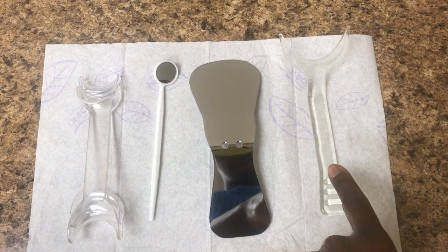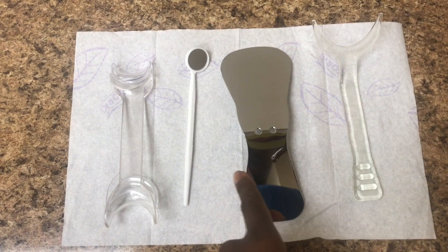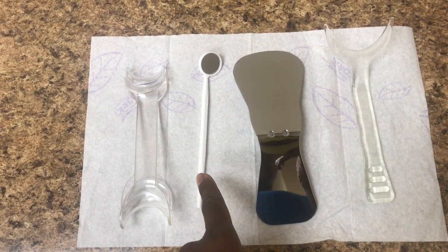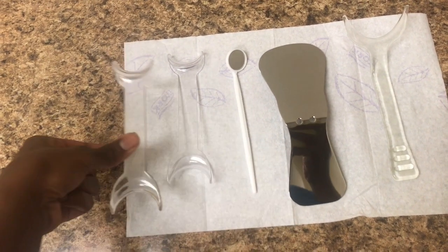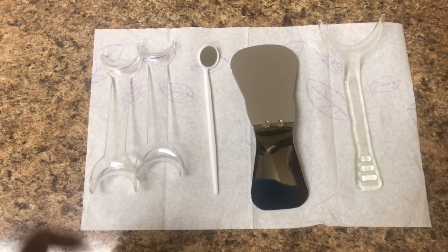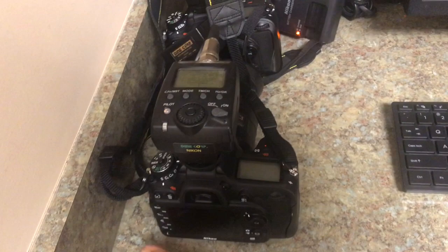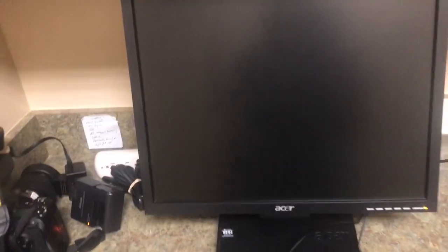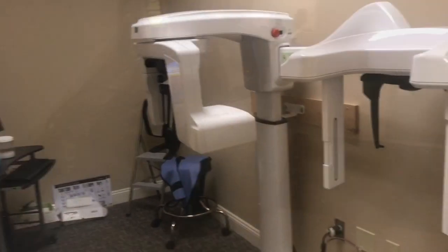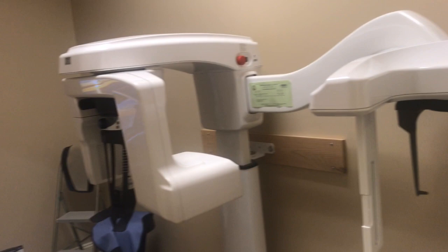Here we have a cheek retractor that retracts the upper and lower lip. This is a mirror so we can take photos of the teeth, and here we have a small mouth mirror that the doctor may use. These are cheek retractors that allow us to pull the cheeks away when taking pictures. Here are the cameras we use when taking photos for our records appointment, and next to the cameras we keep a desktop and printer. Over here is our x-ray room — I will take the patient here to take two types of x-rays, a ceph and a pano.